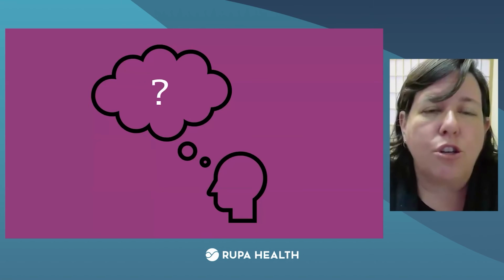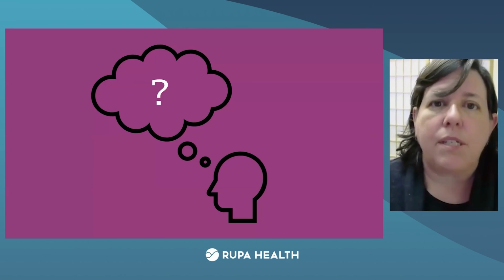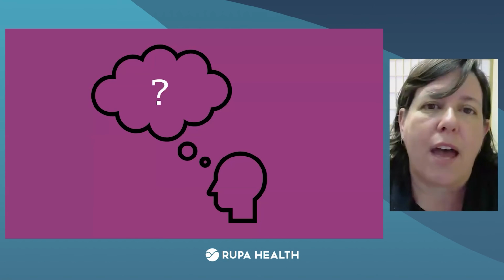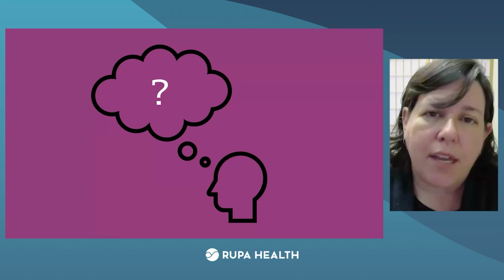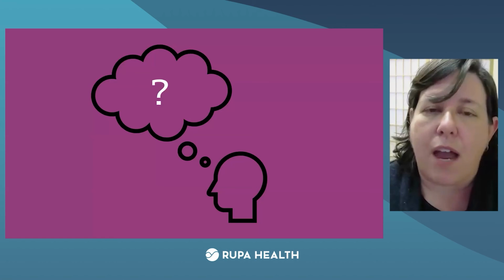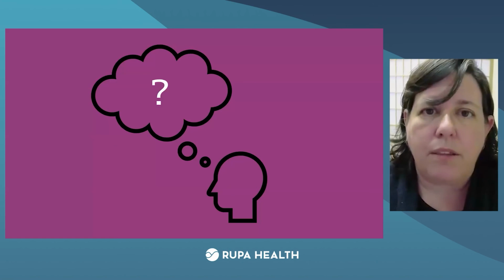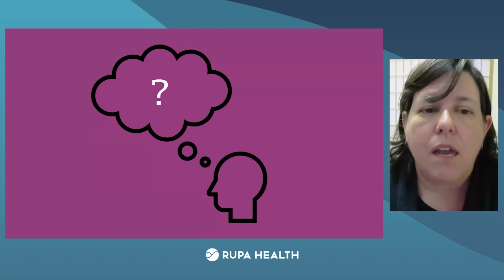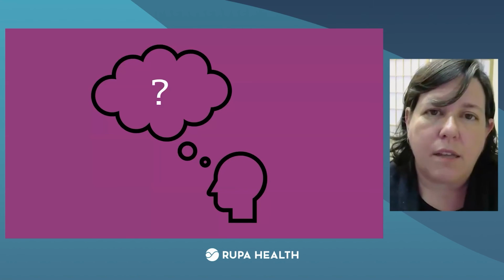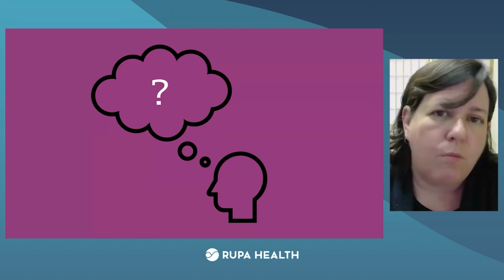Where do I think you should aim for TSH while on medication? I like that TSH to be where most people's TSH is, which is 1 to 1.5. There are going to be people with antibodies. Sometimes you can get down below that 1 before they finally feel okay. And that's going to be much more likely when you're using T3 therapy. But if you've got someone on a T4, you really want it to be down at that 1 to 1.5 range.